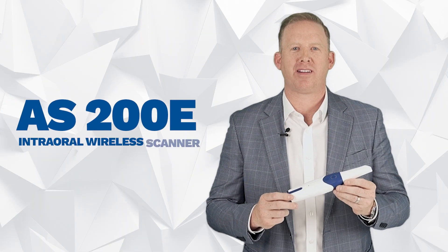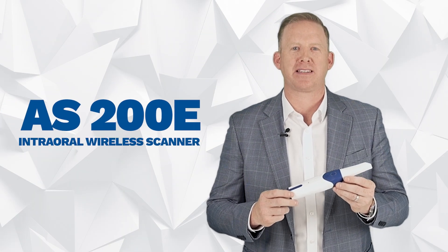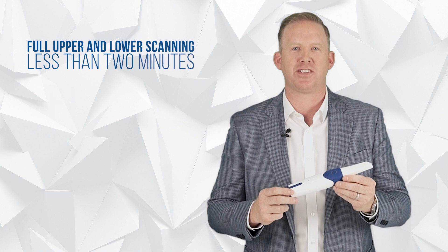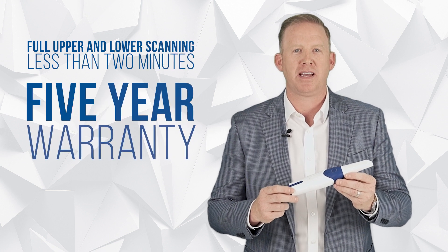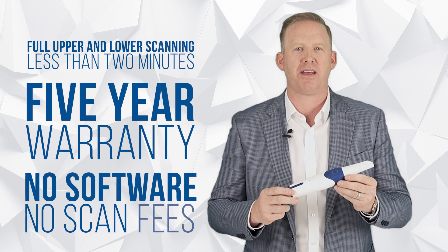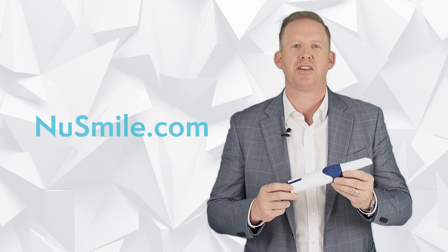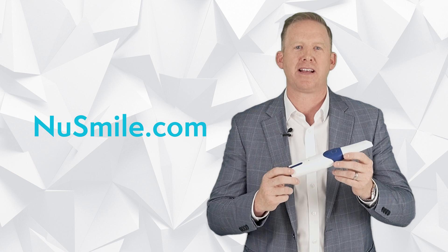The AS200E intraoral wireless scanner is going to change the way you practice. With two tips to choose from — adult and pediatric — full upper and lower arch scanning in less than two minutes, a five-year warranty, and no software and no scan fees, all at a lower price than other intraoral scanners on the market. Visit us at NewSmile.com to learn how the AS200E is going to change the way you practice.